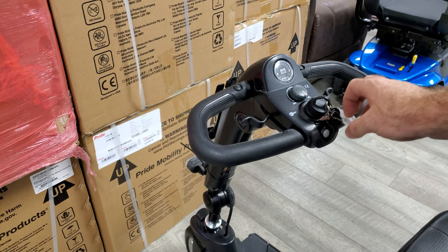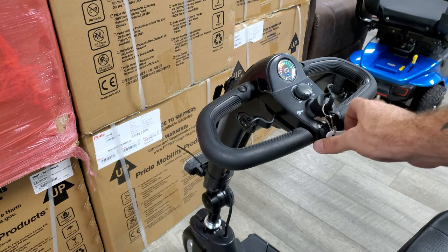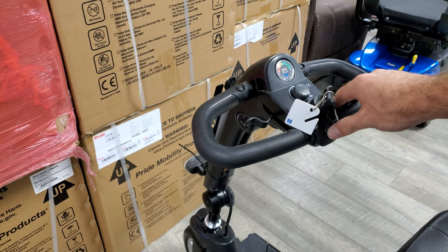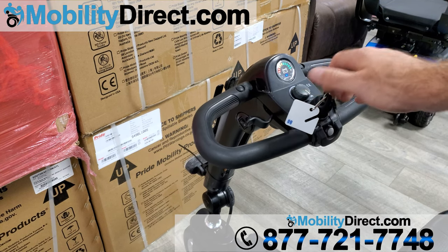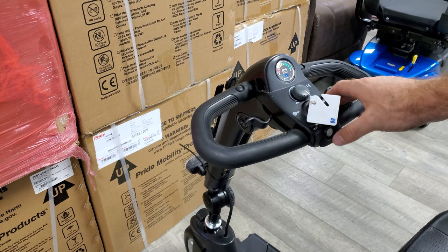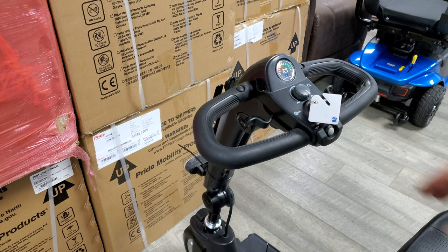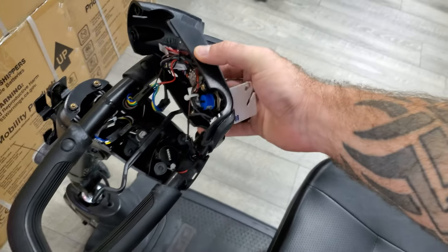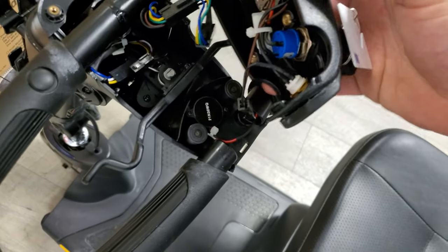In this case we have one that's a little bit faulty — so when you go to turn it on it beeps, but it doesn't hold the beep. We're going to go ahead and replace that.